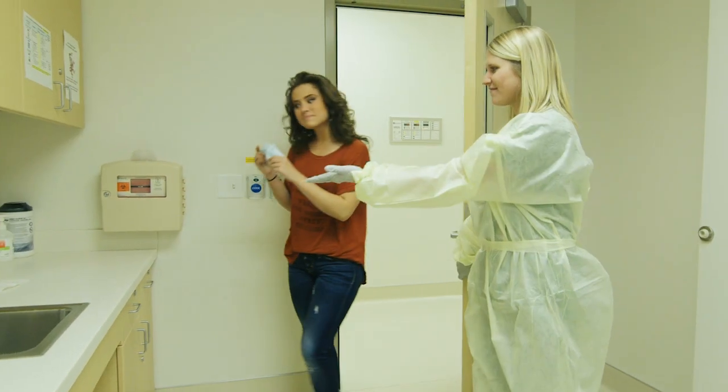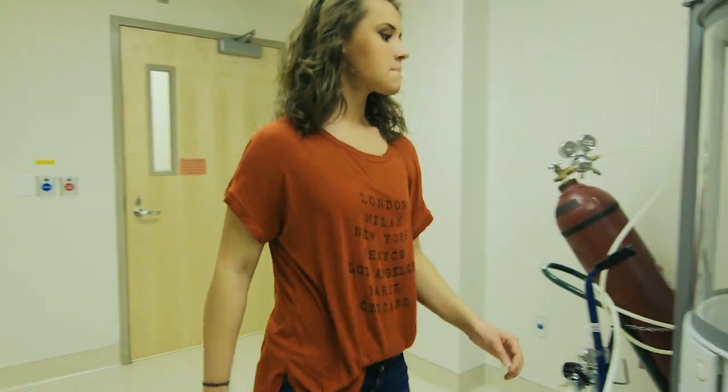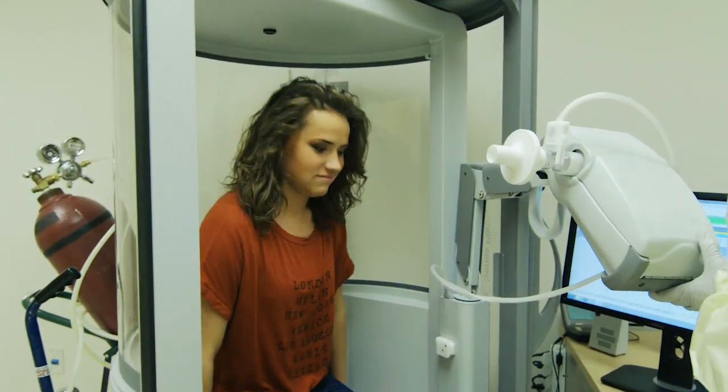Spirometry is a test that can tell your health care provider how well your lungs are working. It measures the amount of air you breathe in, then quickly breathe out over a period of time.